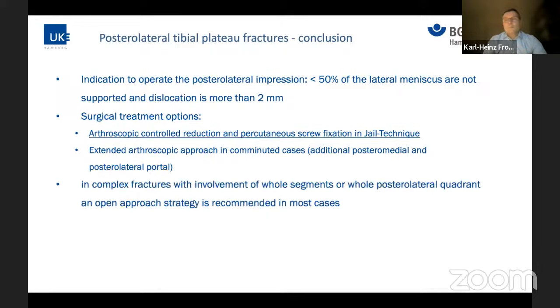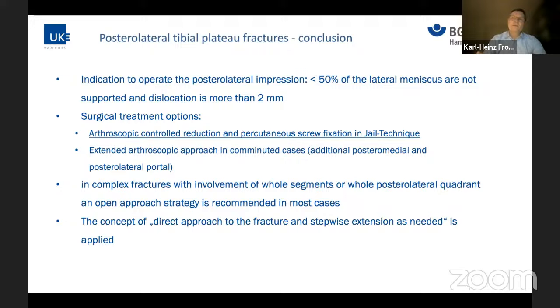In complex fractures, with complex posterolateral involvement, especially when both segments are involved or the whole posterolateral quadrant is involved, depressed, comminuted, whatever, we strongly recommend an open approach in most cases and a really nice fixation. The posterolateral corner, I hope I could show you, is a really important corner for the stability of the knee joint. For us, it's always the concept of direct approach to the fracture and stepwise extension as needed.